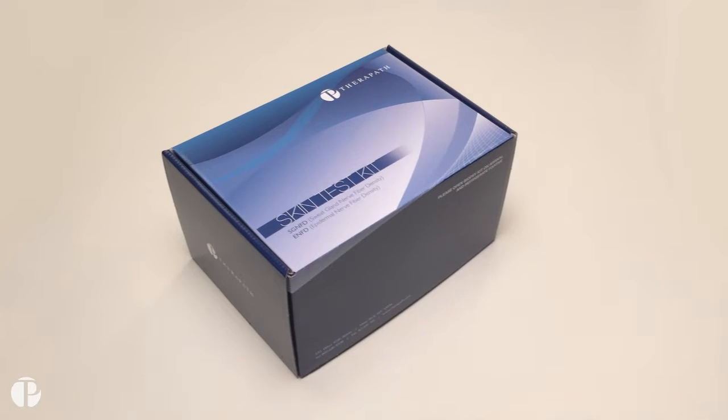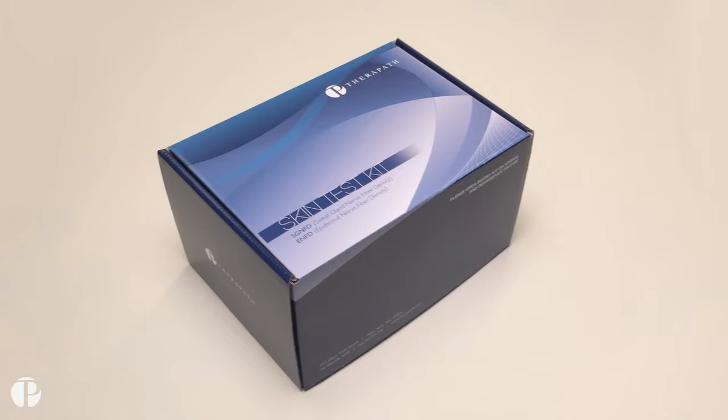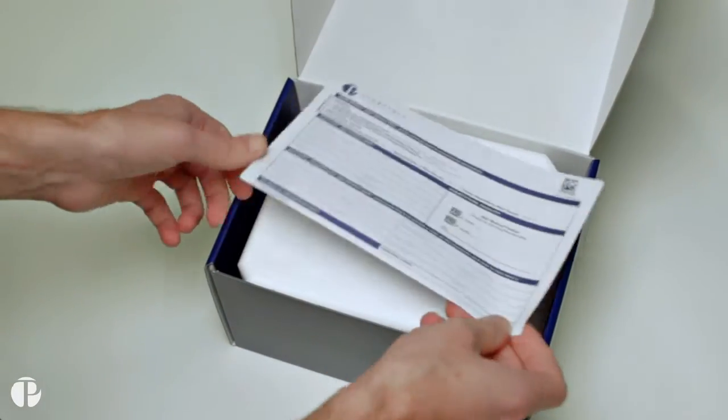Therapath will provide your practice with one testing kit per patient for evaluation of small fiber neuropathy. Kits are shipped to your practice via overnight service. As soon as the shipment arrives, remove the kit from the shipping container.